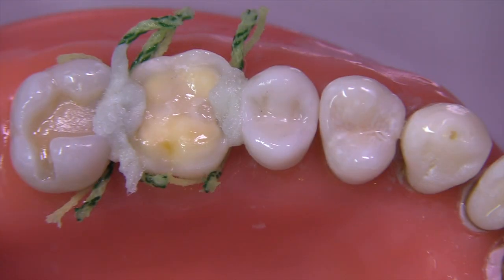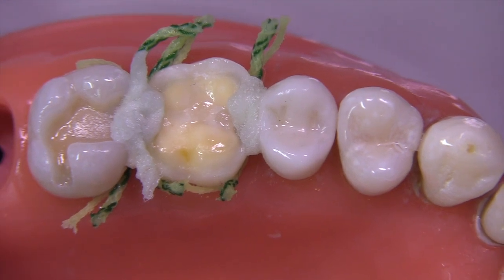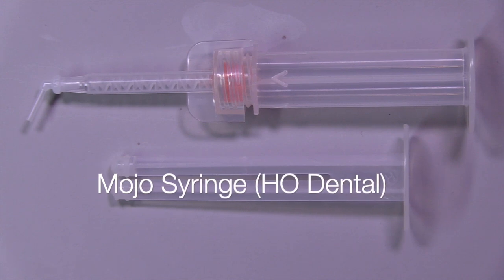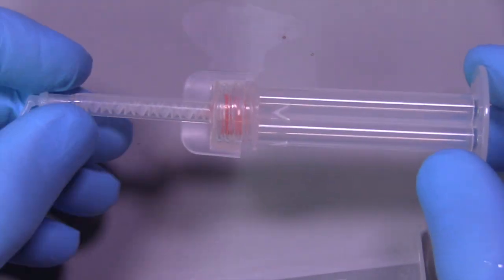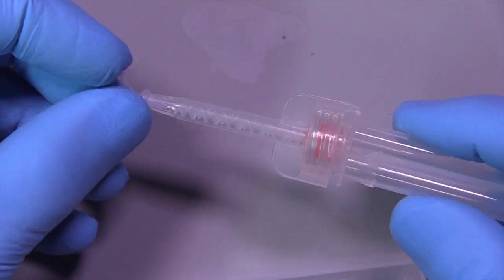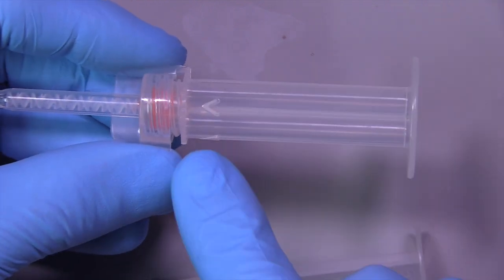Now that we've got the tissues retracted, let's remove the rubber dam and have the patient bite down on a two-by-two while we wait about five minutes before taking the impression. Let's take a look at the impression technique we're going to be using. I like this little Mojo syringe by HO Dental — they're a company out of Las Vegas, and they've improved this syringe over the years. This is their latest version.